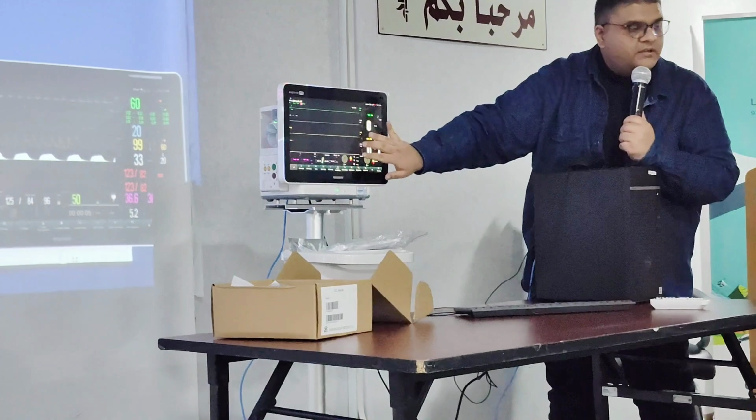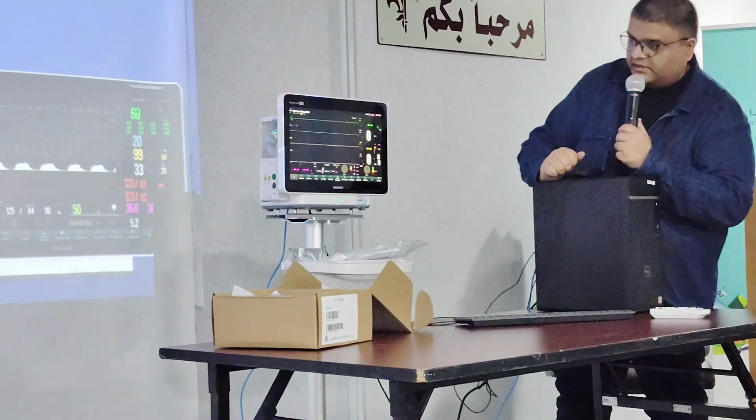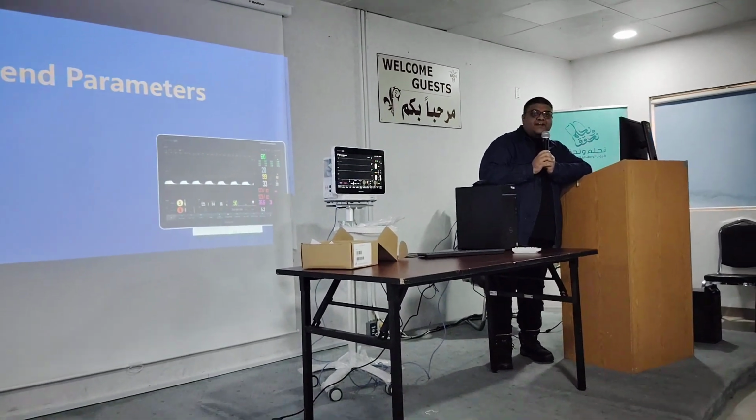Maximum volume. Oh, I hate alarms. Minimum volume. You can go over here and set that. Now I have another question. How do you adjust the brightness?